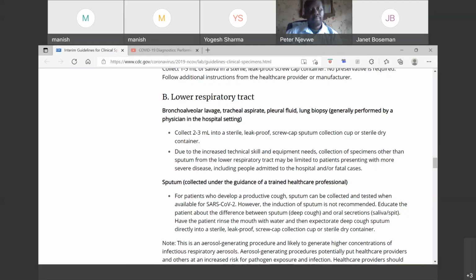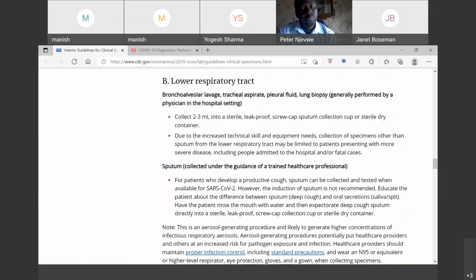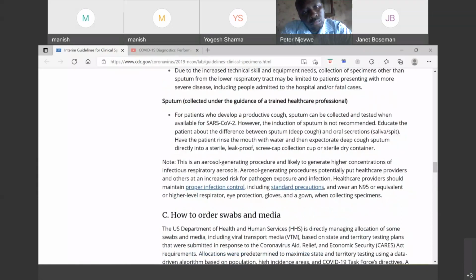Collect 2 to 3 ml into a sterile leak-proof screw cap sputum collection container or sterile dry container. Due to the increased technical skill and equipment needed, collection of a specimen other than sputum from the lower respiratory tract may be limited to patients presenting with more severe disease, including people admitted to the hospital or fatal cases. In some cases, if the coronavirus infection goes into the lungs, a nasal cavity or buccal cavity swab may not be appropriate to identify the coronavirus, because the infection has reached the lungs. So there would be a different technique for the collection of this kind of specimen.